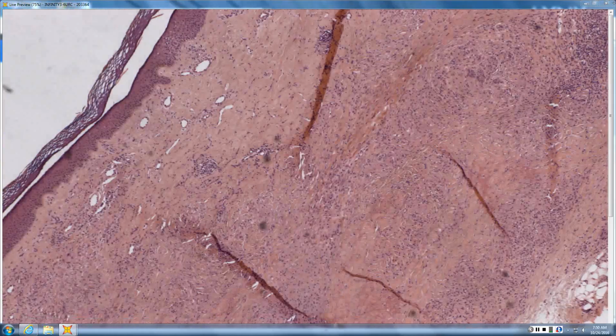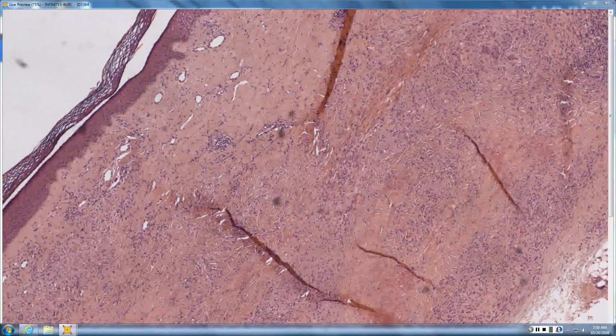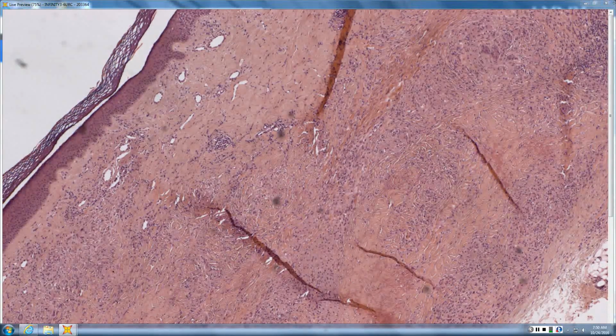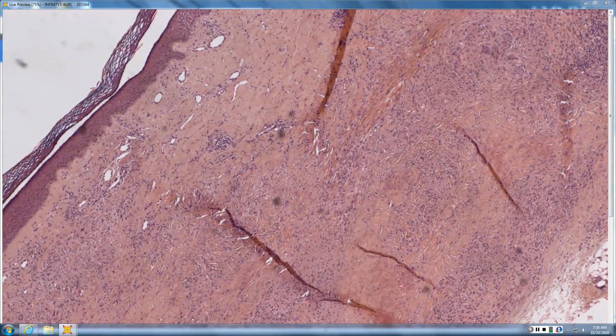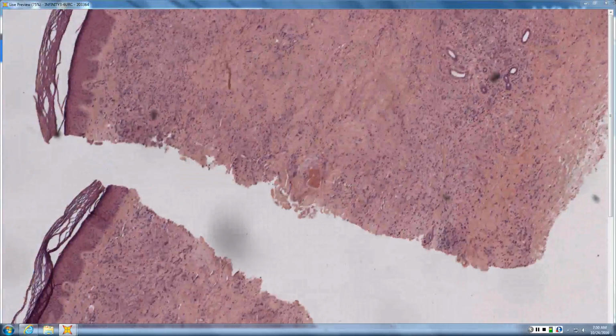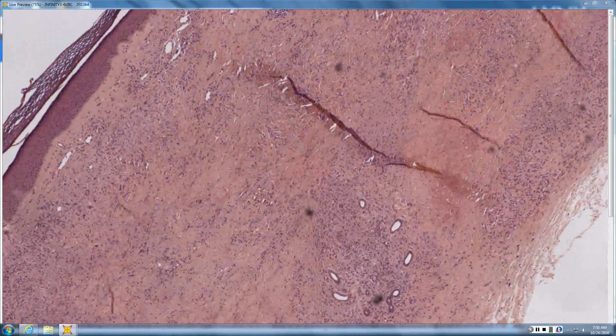Rob, what do you see here? Thick sclerotic collagen, a diffuse infiltrate, somewhat horizontally oriented. It looks kind of top to bottom, side to side, with a square non-mushroom biopsy, right? That's for those necrobiotic lesions, where you can see the non-mushroom square biopsy. Okay, so necrobiosis lipoidica, NLD, I'd probably put at the top of the list.